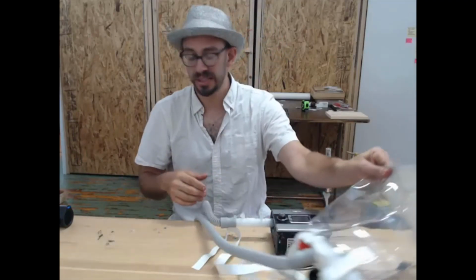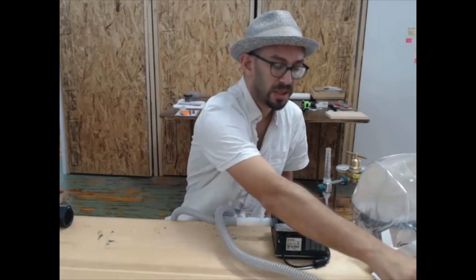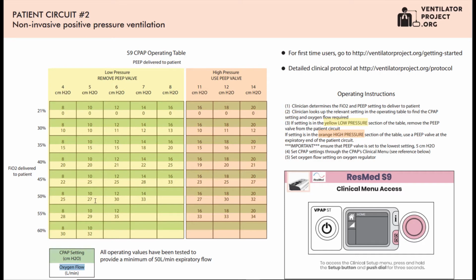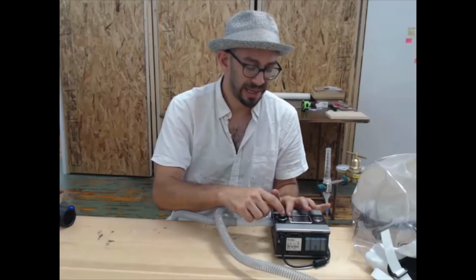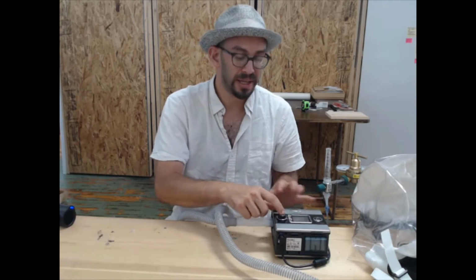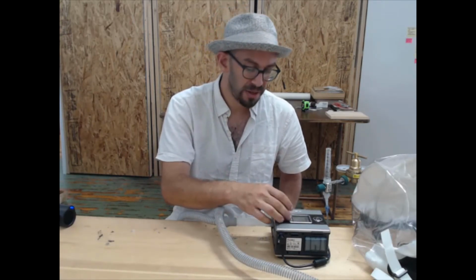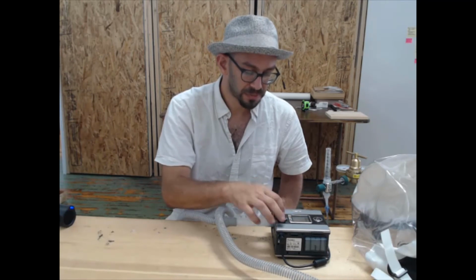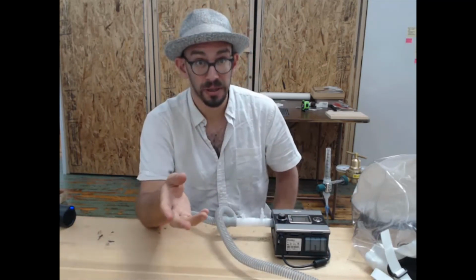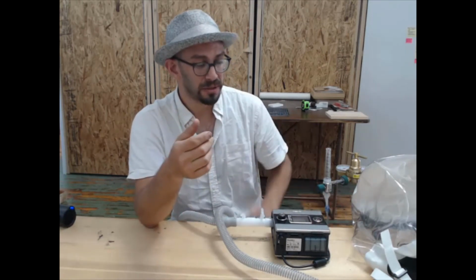In order to set the CPAP, I need to get into the clinical menu. You have a reference guide right here that shows how to get into the clinical menu of your model CPAP. And go in, and once you're in the clinical menu, there is a menu option that lets you adjust the pressure. You want to adjust that pressure to 10 centimeters of water pressure. Once you have it adjusted, hit start.